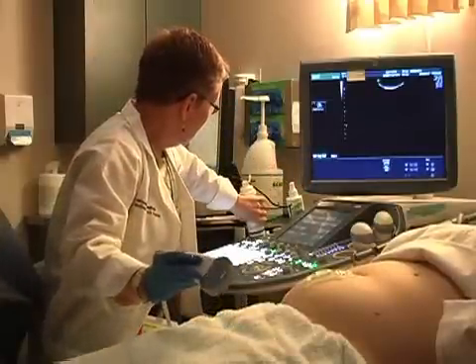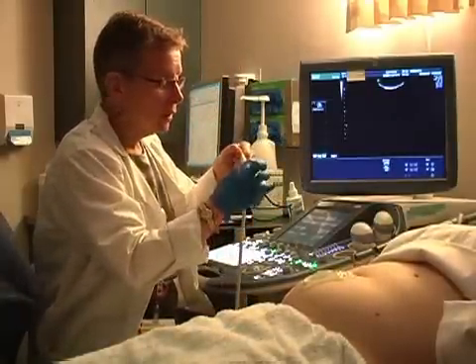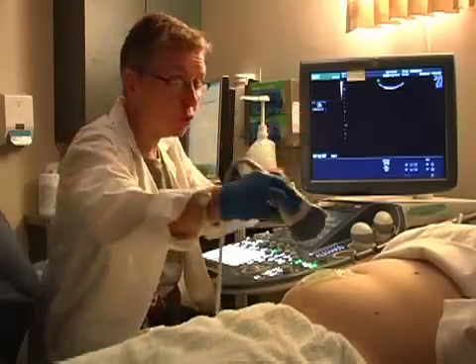The first thing I'm going to do is just talk a little bit about the probe. As you can see when you look at the probe, there's a ridge right here. I'm going to put that, when I scan, up and down so it's toward your head.